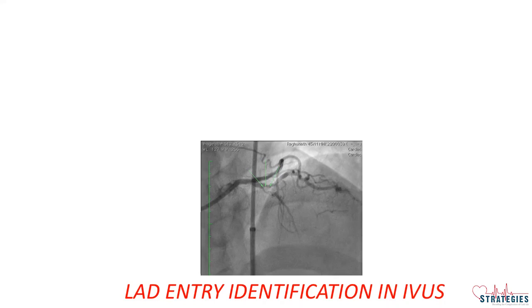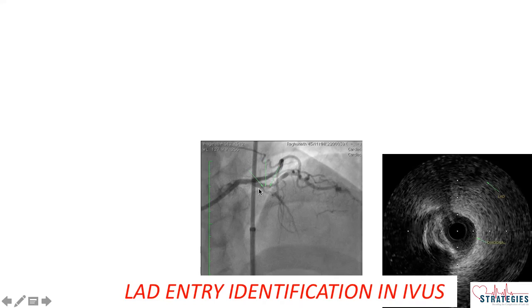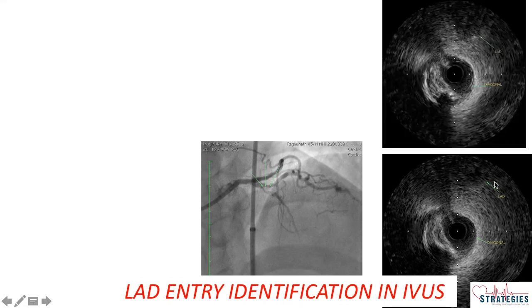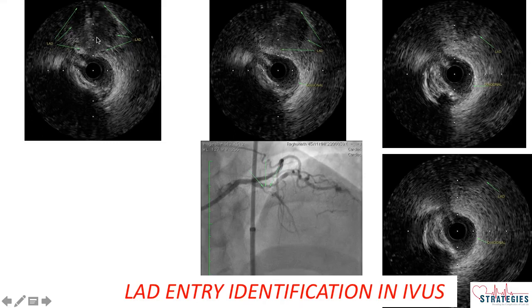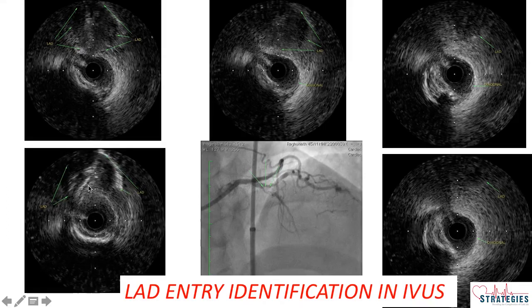Coming to the LAD entry identification in IVUS, while coming through RAMUS we can observe this is the site of LAD, and we can see gradually this becomes a circle and then joins the diagonal. This is the LAD here, and in the next shot a complete circle is visible — this is LAD, this is the media, and this is the true lumen, joining diagonal. There was a suspicion of a nipple, but if you see in IVUS there is a small entry or nipple which is visible into LAD with blood sparkling into the LAD — so this is the entry point.